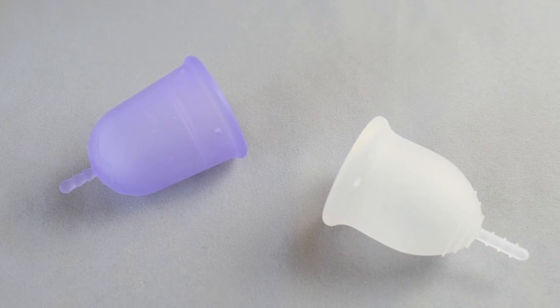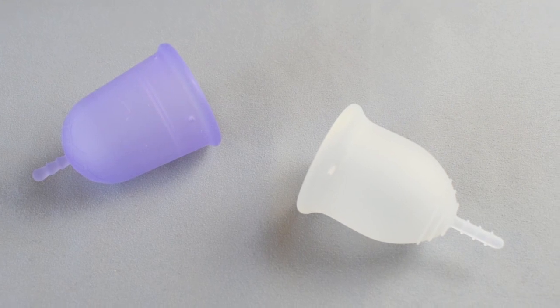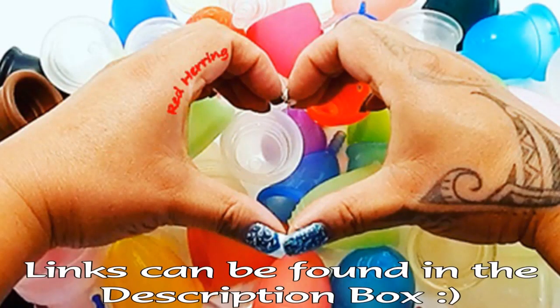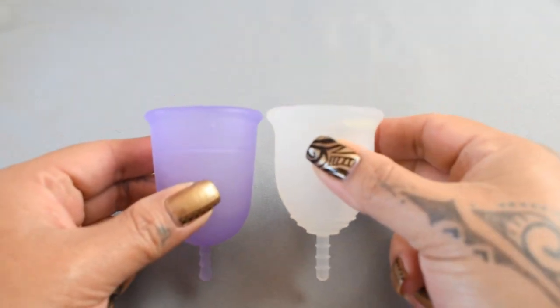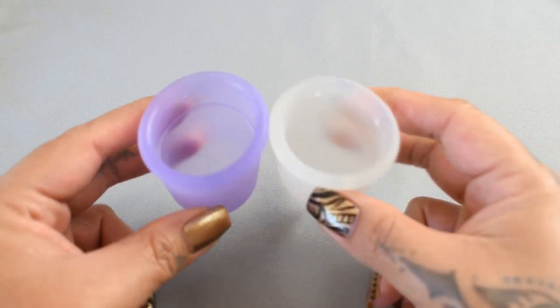This is a squish comparison between the Venus cup and the Lena cup in the sensitive version, both in a size large. I'm going to place both of these cups in the palms of my hands, give them a squish, swap hands, give them a squish again, and then compare the rims.